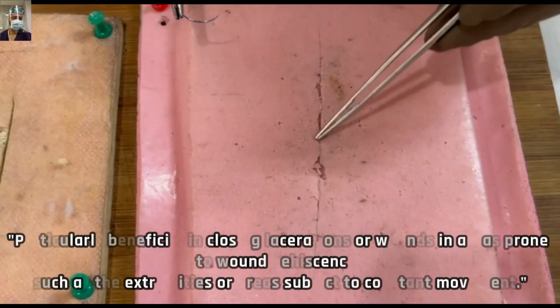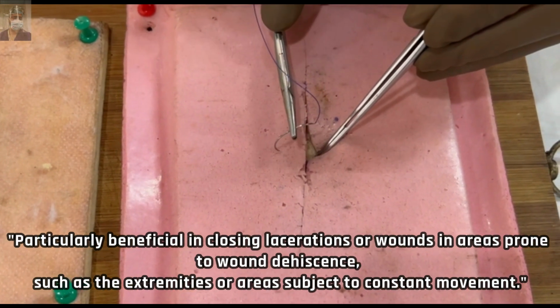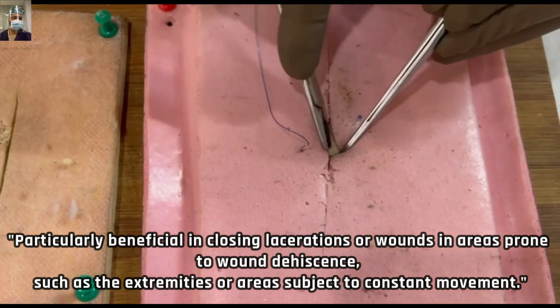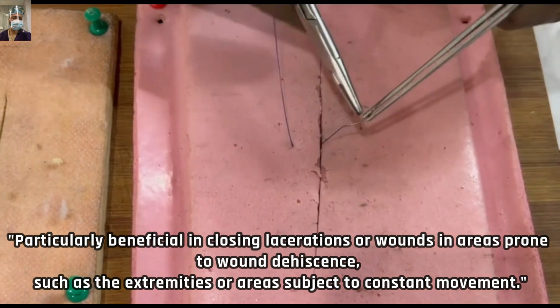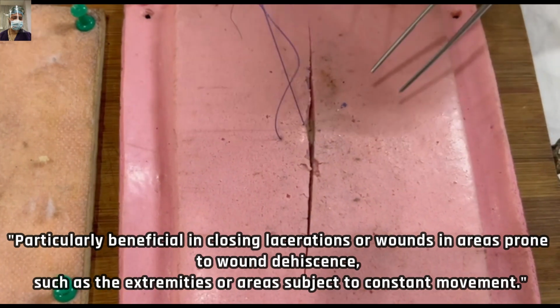So we start simply with the far suture, as in the vertical mattress suture or the simple interrupted suture. Then, at a similar distance from the wound margin, I progress along the wound margin. The distance is approximately the same.